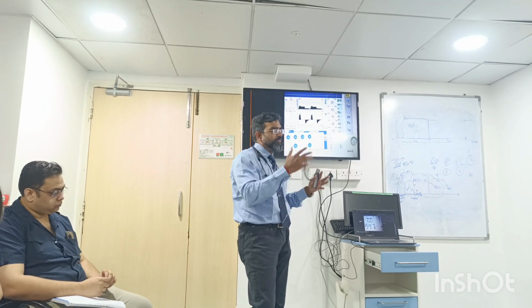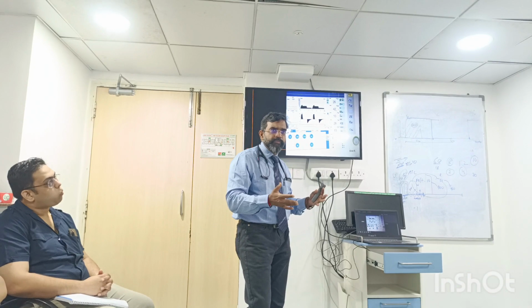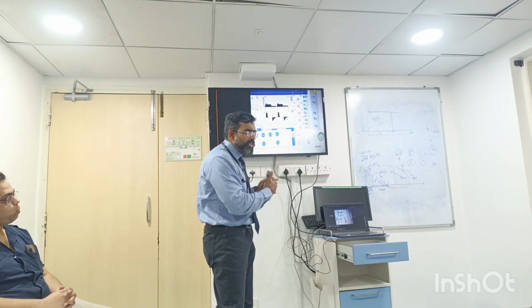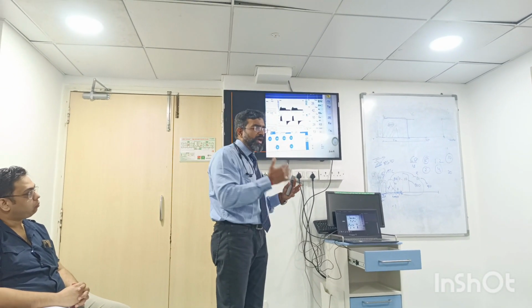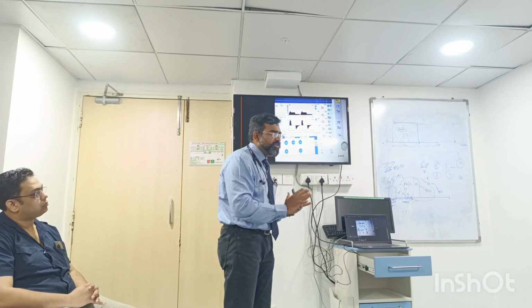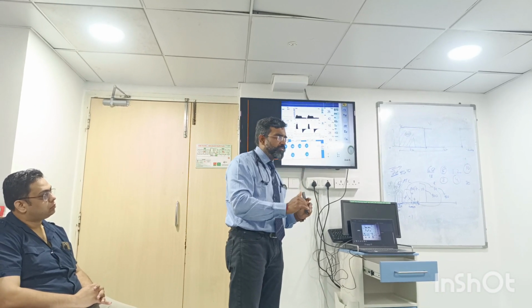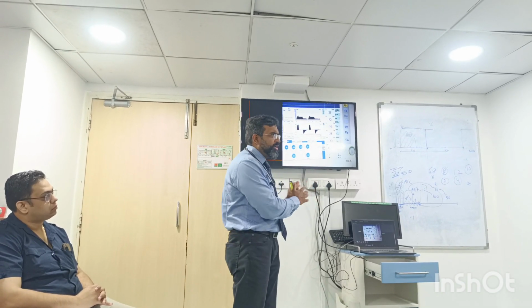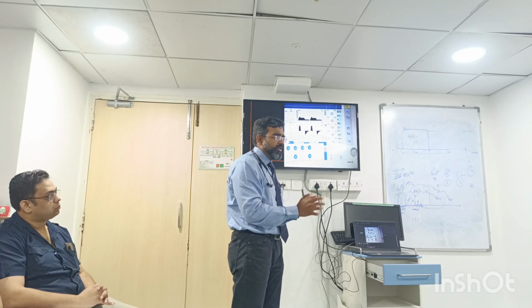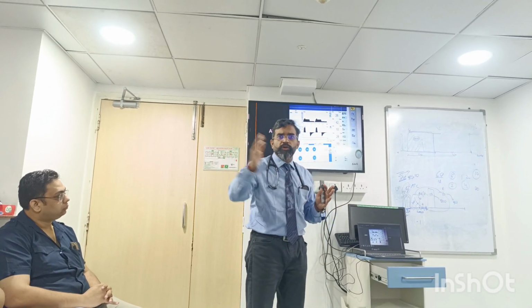I don't need to be at that 1:1 non-physiological inspiration expiration, because he's improving. So when you come back, you're supposed to check all these parameters. If you started with a compliance of 10, and now the compliance has gone to 15, oh, the patient is improving. It's come to 20, wow, it's better. If 40 is normal, and I'm reaching say 25, oh, I don't need to give so much, let me go slow. And these changes are not done immediately. These changes are done during the course of your 12 hours.